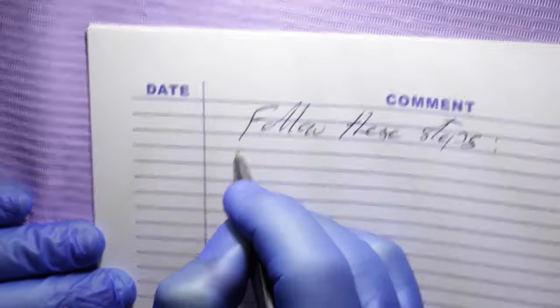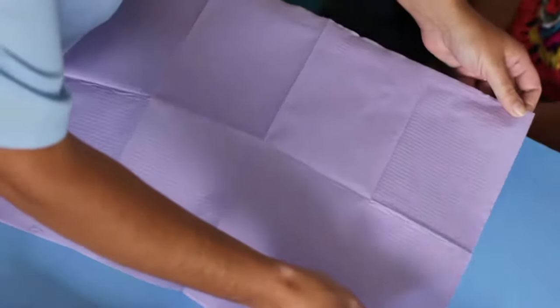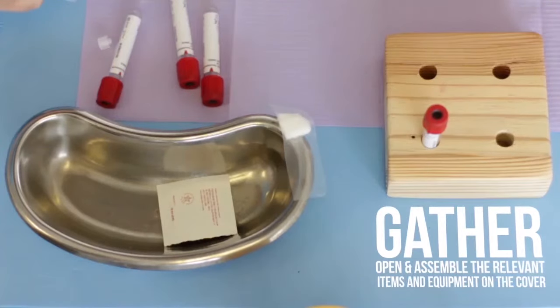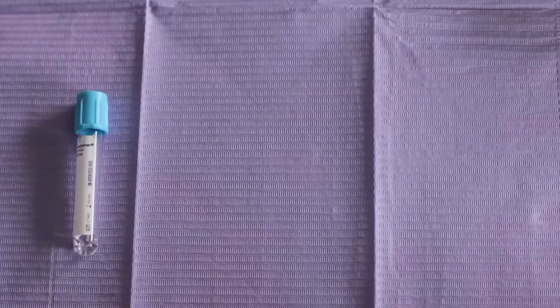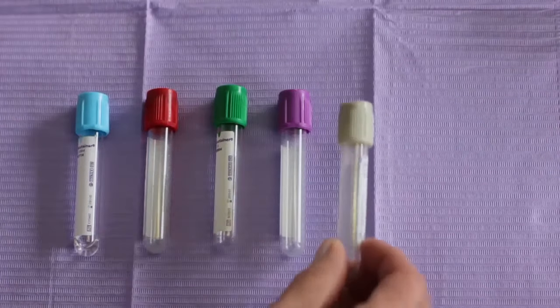Now, follow these steps. Start by opening a clean work surface cover, then gather, open, and assemble the relevant items and equipment on the cover. Set out all the tubes you will need by the order of the draw.